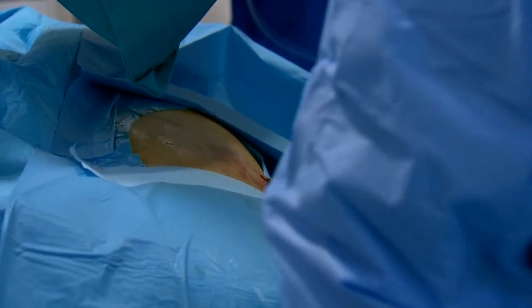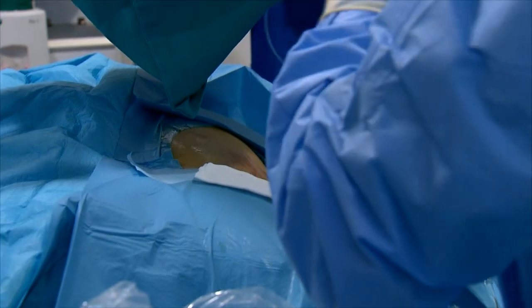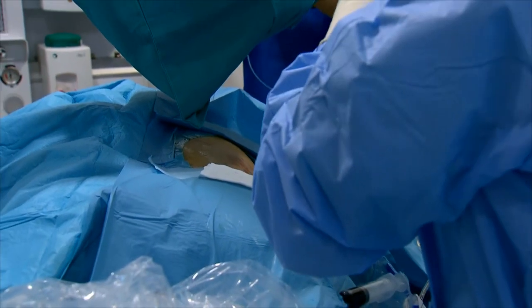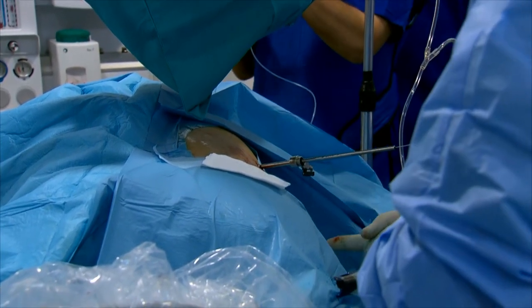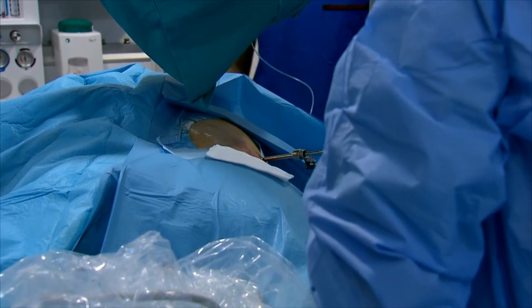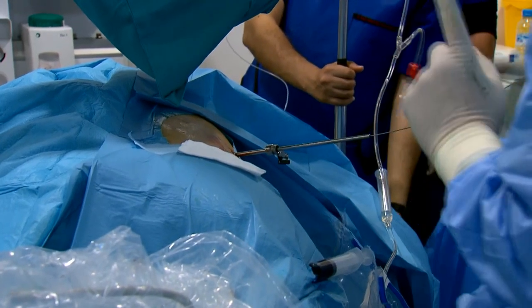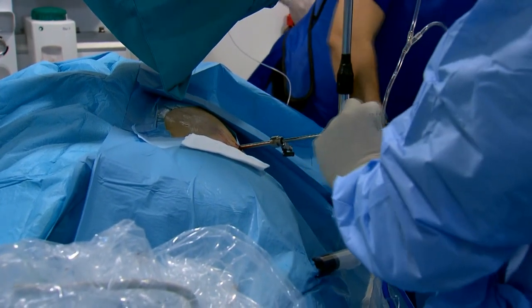You don't go up to the pelvis. The tip of the Amplatz sheath is only in front of the lower calyx. But we are inside the calyx, you can see the blue color. We see it clearly, this is a good sign. The next step is to remove the dilator.